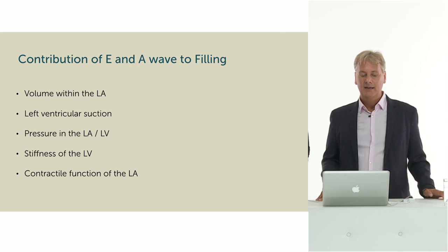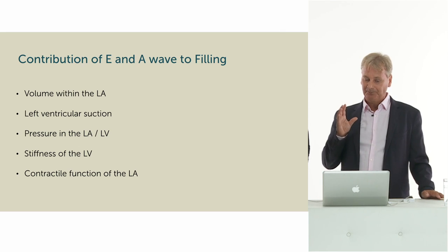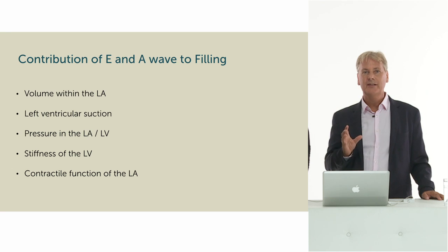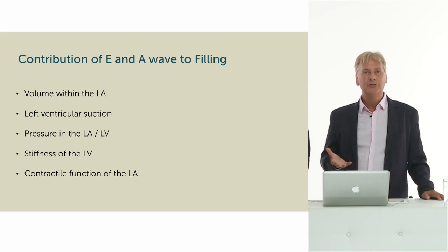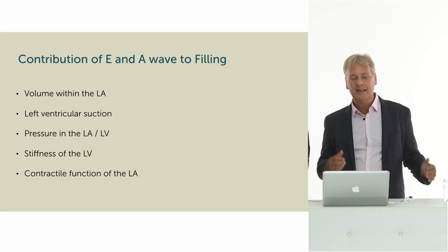Okay. I do want to mention that we have to understand why patients get an E wave and what affects the A wave. And this is very important because even the guidelines say that to really assess patients with diastolic dysfunction, you always have to understand what these parameters really reflect. And if you have a thorough physiologic understanding, sometimes you don't need to go through all these flow charts. It will just mathematically be understandable to you.